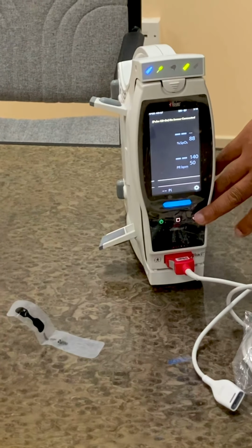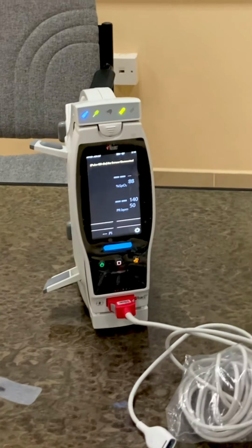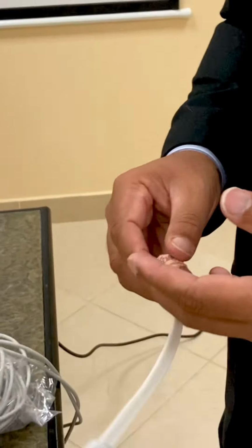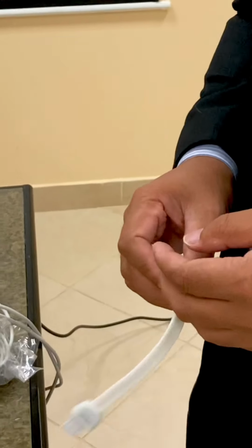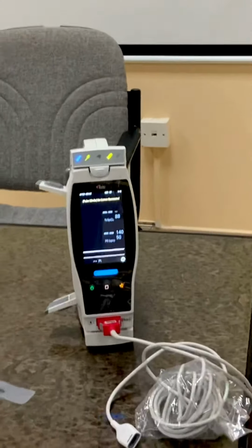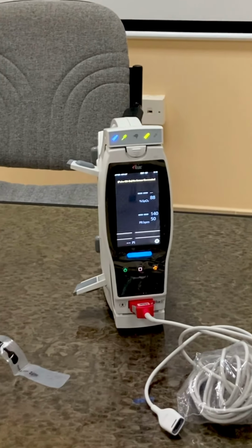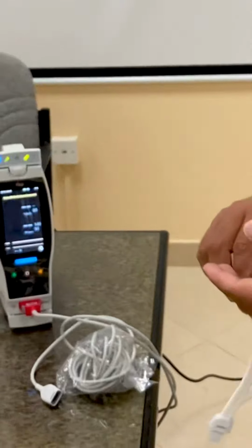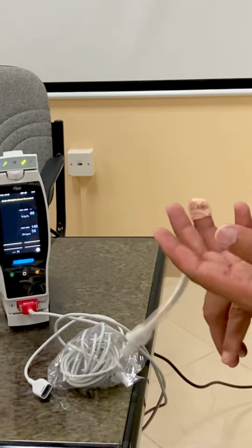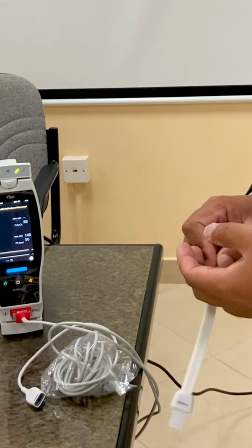If it gets wet, will it work? This one? Yeah, for example, if the patient is going to the bathroom. With this one, no. We never promoted this one, because we don't want to make it wet. We have to remove it and then apply a new one. That's the better option.